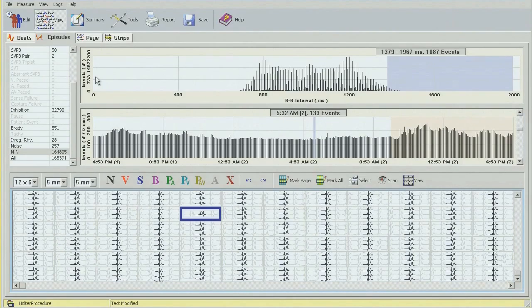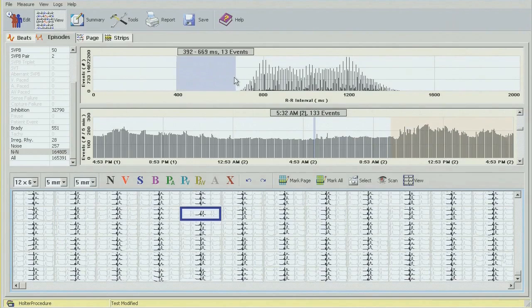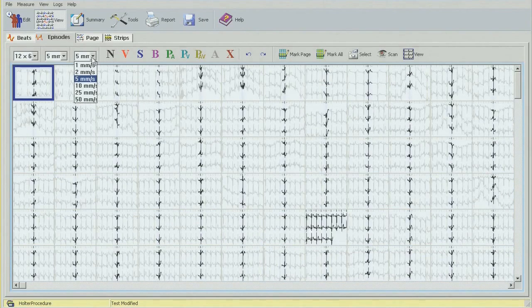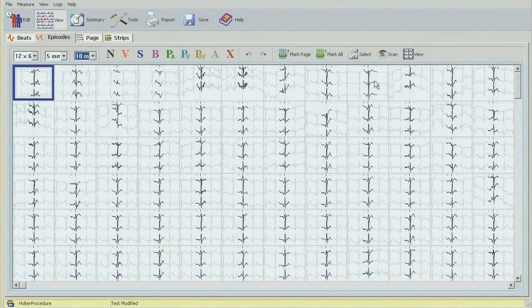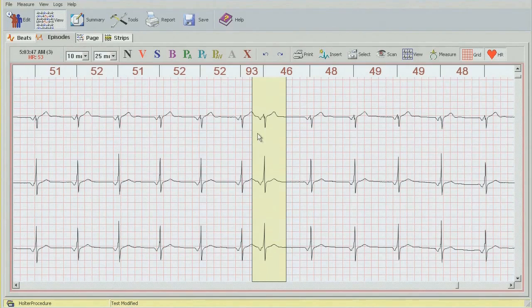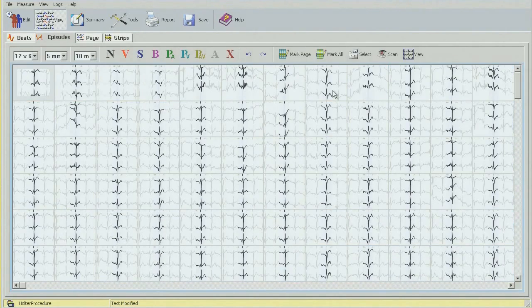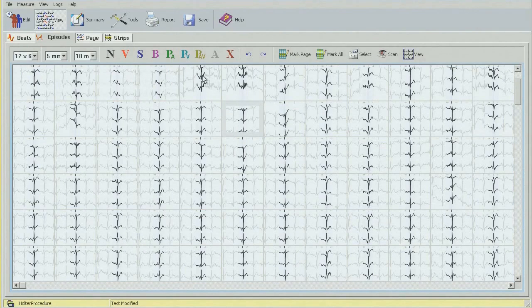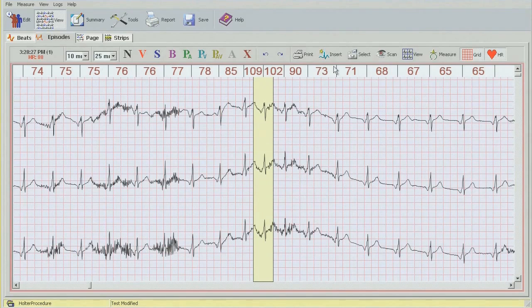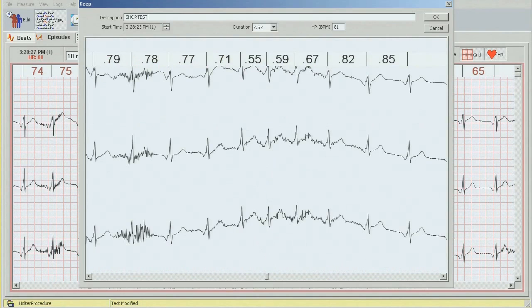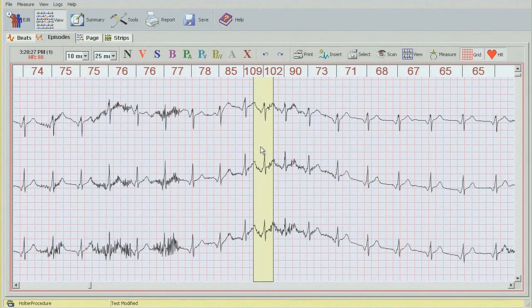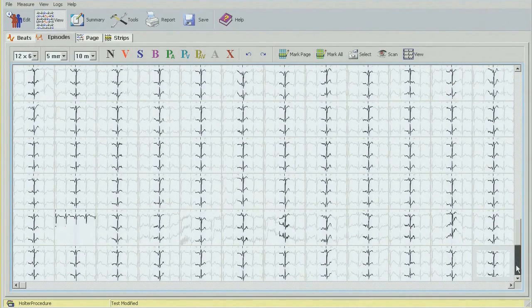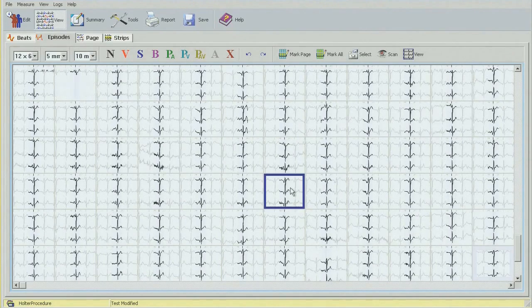Now checking for the shortest NN — same idea from the other side, holding the left mouse button and dragging over. Z button to look at it. I'll change the speed to 10 because the rate is a little higher. There's a supraventricular beat here which I'll change from full page mode. This is our shortest NN, so I'll go back, double-click on the beat, and label it. Clicking through the rest to see if nothing is missed — they all seem to be fine. Z button to go out.